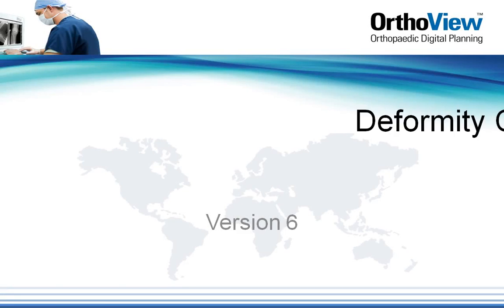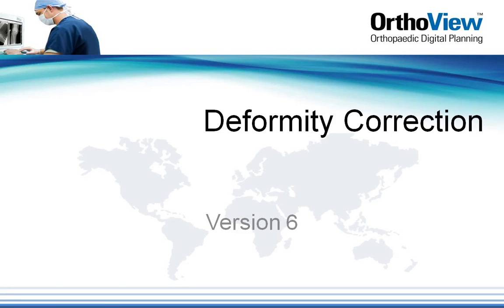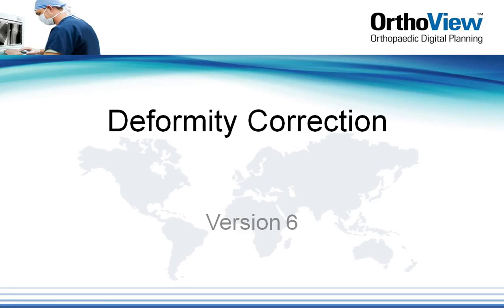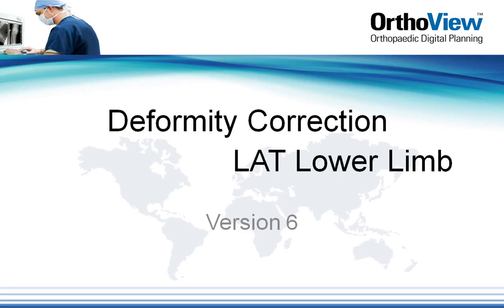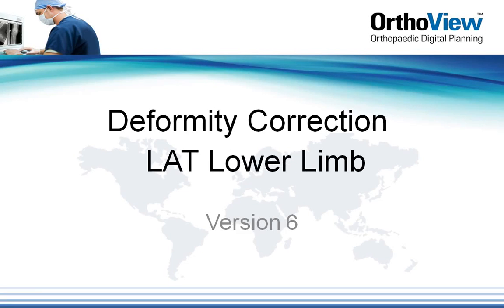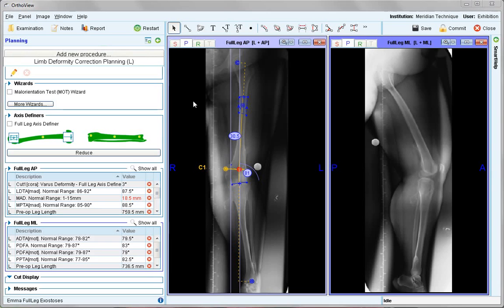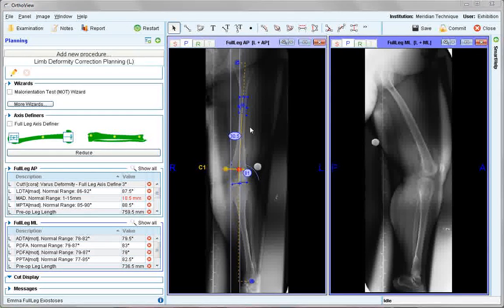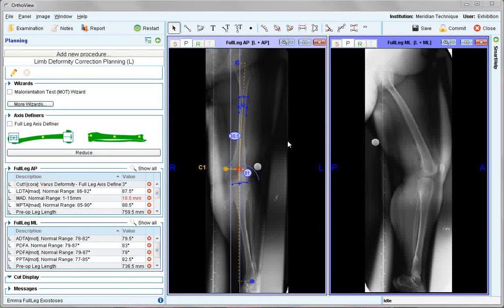This tutorial reviews deformity correction planning in the lateral lower limb. This video of the lateral lower limb should be viewed in conjunction with the AP lower limb tutorial, as the basic concepts will not be covered again here.